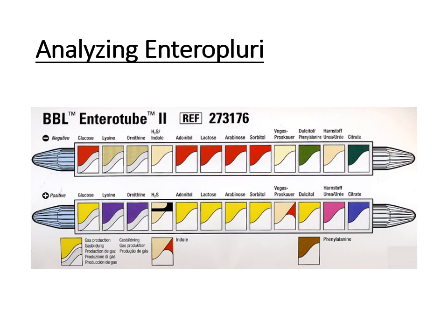Now, ultimately, the way we analyze these Enterotube tubes is we think of what the tube looks like before inoculation, all of the initial colors, and then we look for any changes in color or the lifting of any wax showing gas production.